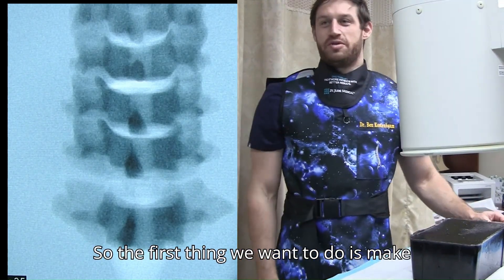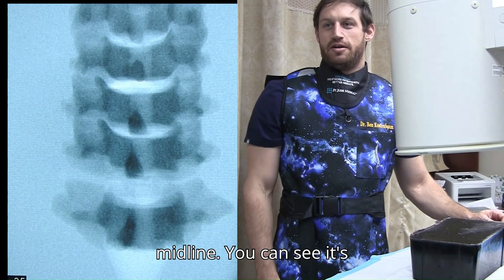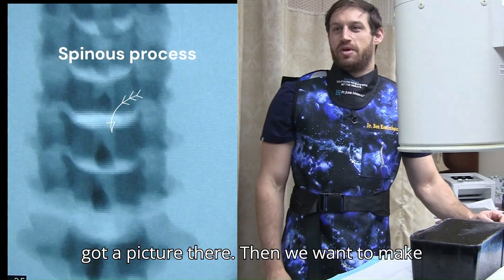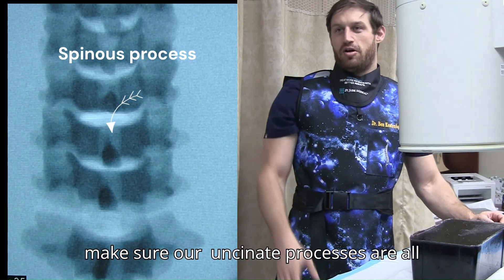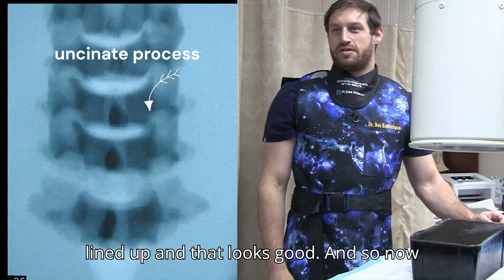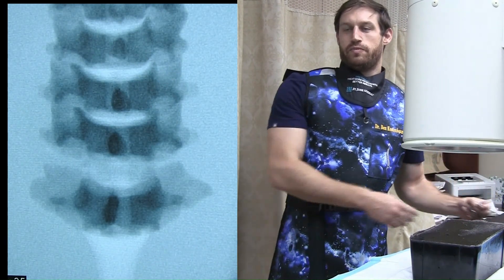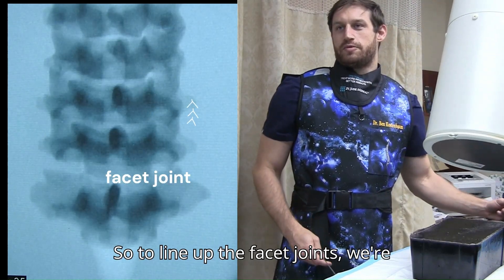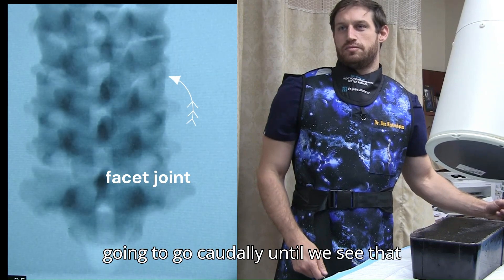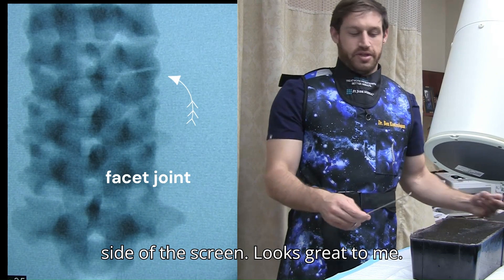The first thing we want to do is make sure our spinous processes are lined up midline. Let's see if we've got a picture there — we want to make sure, now that we're midline, our spinous processes are all lined up, and that looks good. So now we're going to get our facet joint lined up so we can get it nice and open. To line up the facet joints, we're going to go caudally until we see that facet joint opening up on the right hand side — looks great.